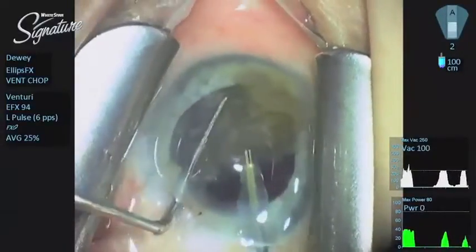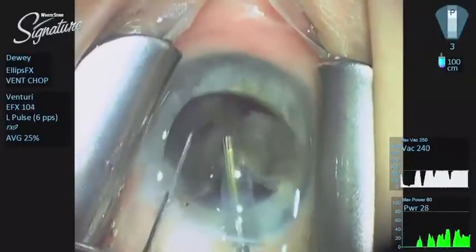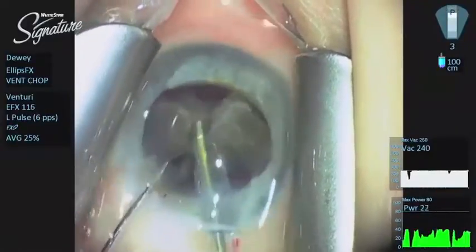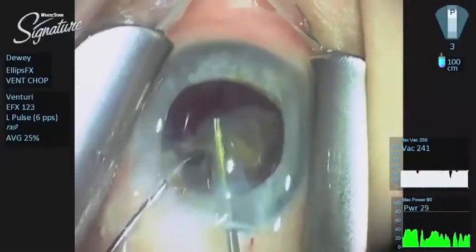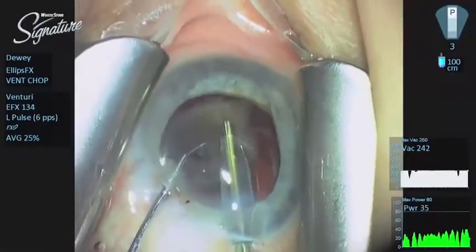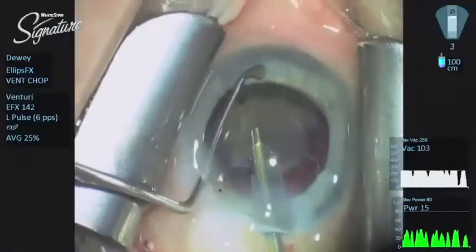The only difference between peristaltic and venturi is whether the vacuum is live — as in venturi vacuum — or whether the vacuum is dependent upon achieving occlusion. Studies comparing various gauges of needles versus various bends have demonstrated that venturi vacuum is much more efficient than peristaltic when looking at the power used to remove a nuclear fragment. You are getting more effect with the power delivered at the needle using venturi vacuum, because venturi is always live — you never have to re-attain vacuum.